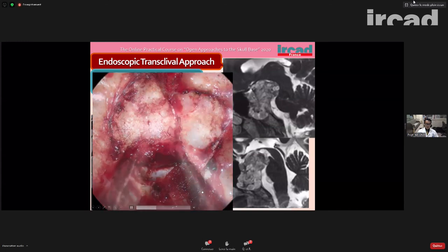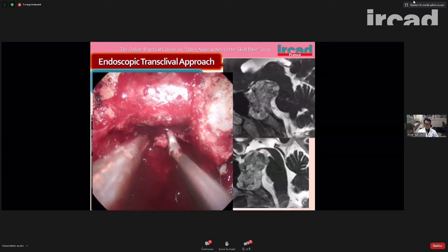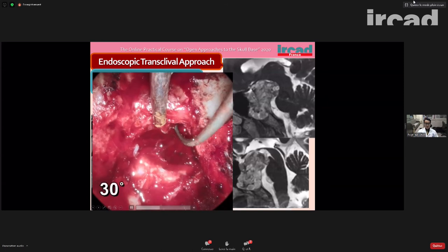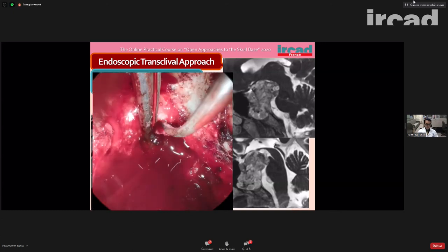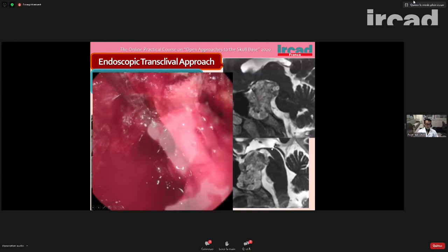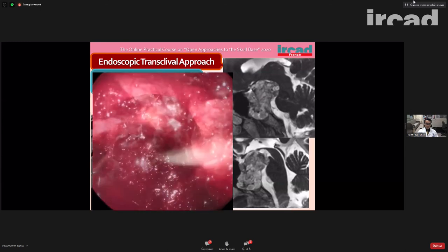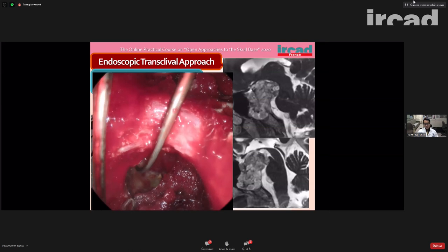And try the removal of the dorsum sellae. The tumor stump is exposed here. Then we change the scope to the 30 degree and look up at the dorsum sellae, and there is a residual bony component here. Then we start the mass reduction. Like this, and after sufficient mass reduction, we start to remove the tumor capsule.